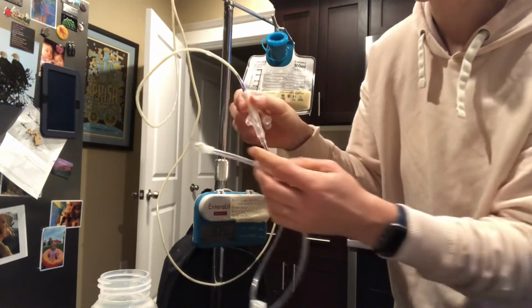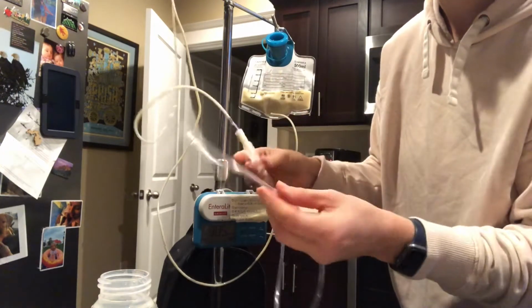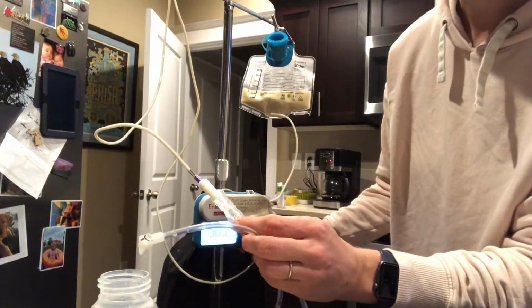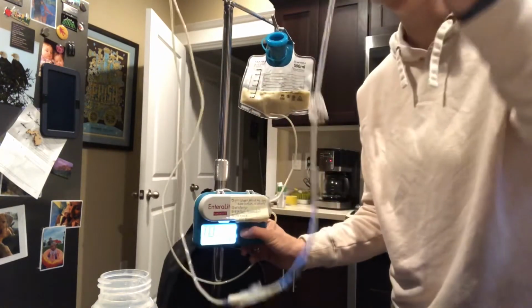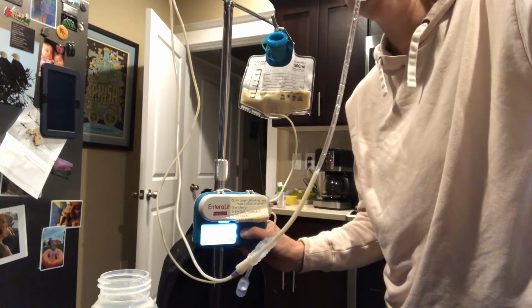That's happened to Chris and I many times where we've forgotten to close it. Usually you notice it right away because there's formula dripping all over the floor. Sometimes it takes a few minutes. And then I'm just gonna push the prime button again and just let the milk prime through the tube.